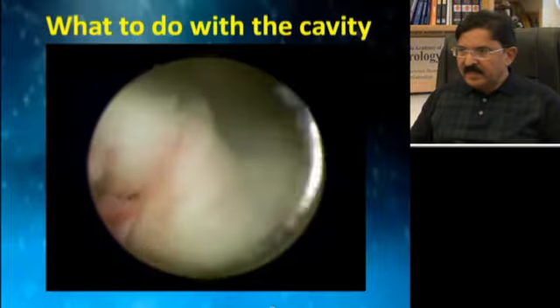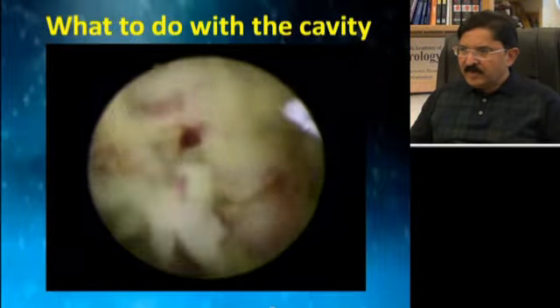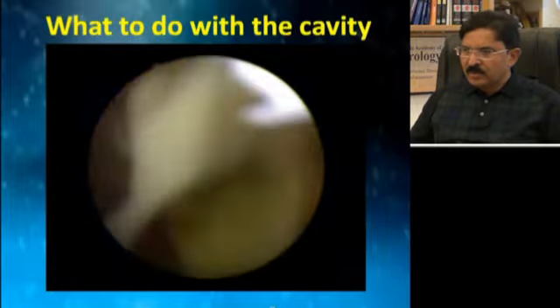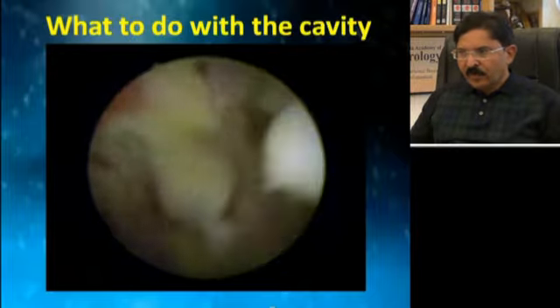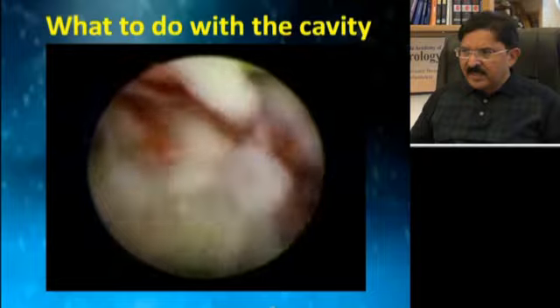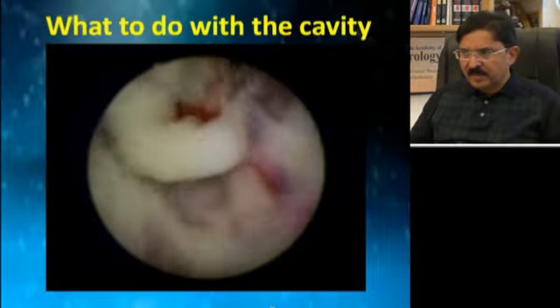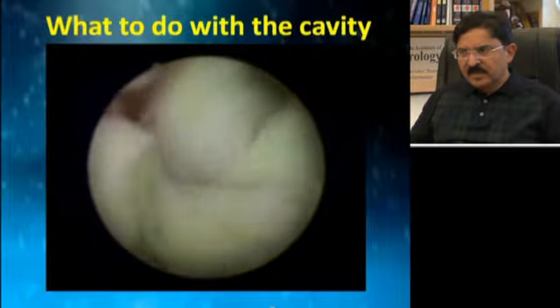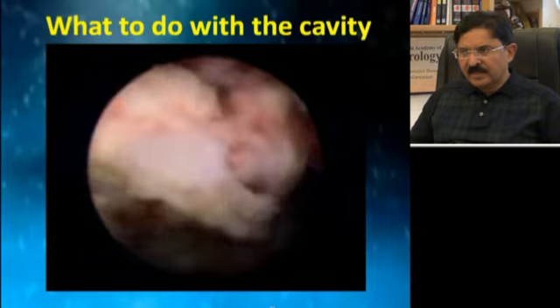And then you enter the cavity, and if the pus is organized like here, you have to move the loop and make retrograde strokes, reverse strokes, to shave off the pus that is adhered to the wall of the abscess cavity. The intention is, by irrigation fluid, wash out the entire abscess cavity. This is very important. Don't leave it for nature to take care of later on. As a surgeon, remove all the pus, put it back into the bladder, and then drain the bladder, and that would be a good thing to do.